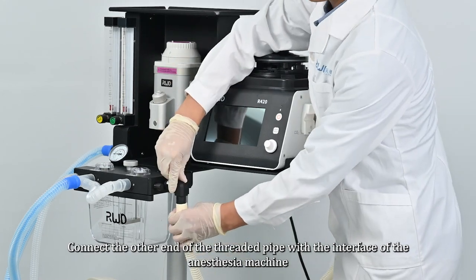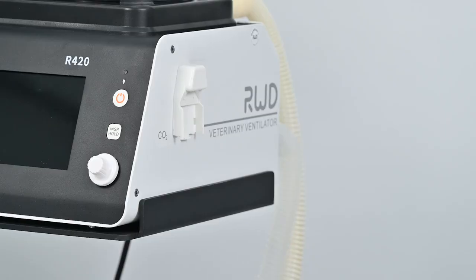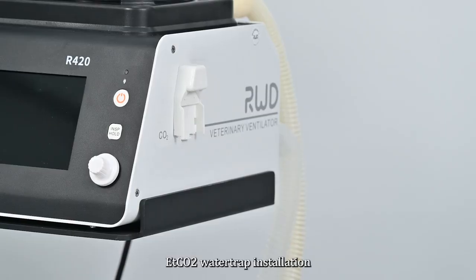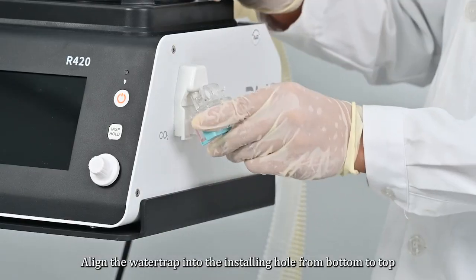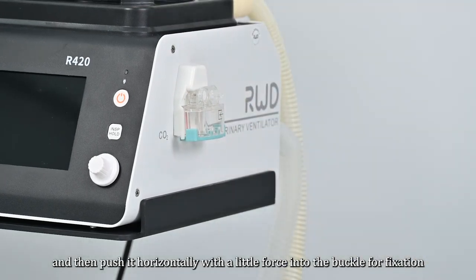Connect the other end of the threaded pipe to the interface of the anesthesia machine. For ET CO2 water trap installation, align the water trap into the installing hole from bottom to top, then push it horizontally with a little force into the buckle for fixation.